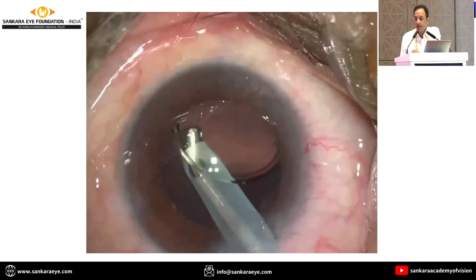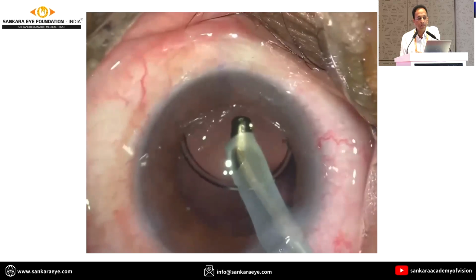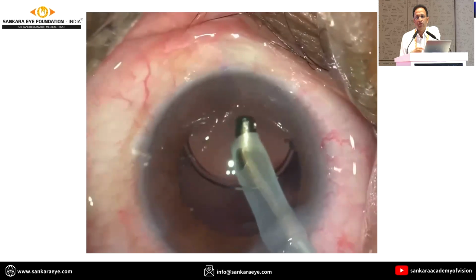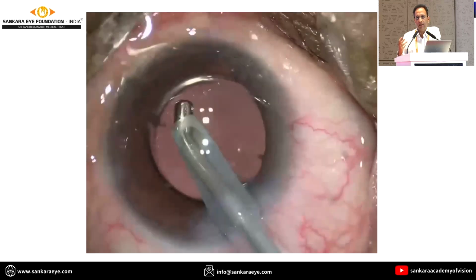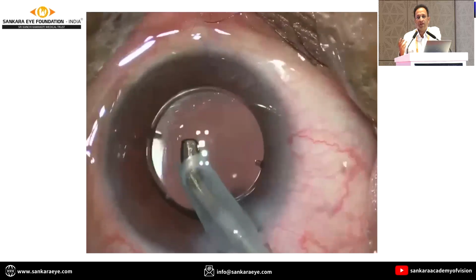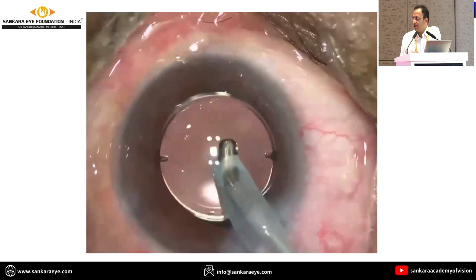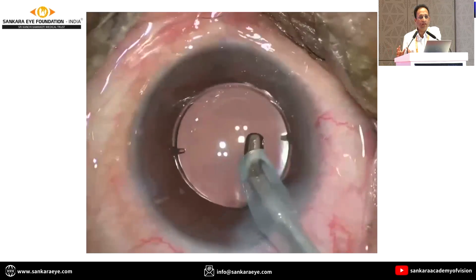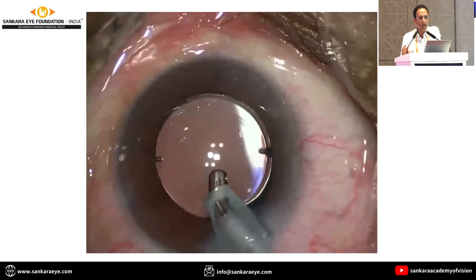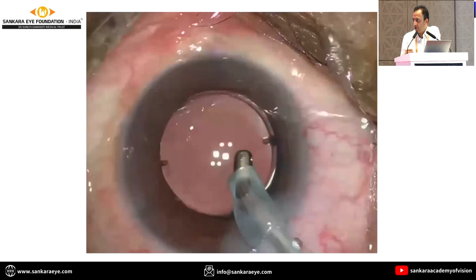Just to emphasize, cleaning the OVD behind the IOL, in the capsulorhexis, and to me it depends on the thickness of the IOL. The Alcon types, where the refractive index is on the higher side and the lens is thin, open up faster, whereas the Technis opens up slower. So wait for the haptics to completely open, spend 1 or 2 minutes, then rotate and then stabilize the patient. That would be my key takeaway to ensure that you get good success.